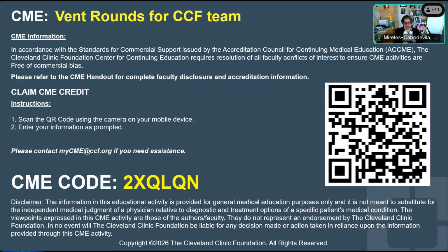Importantly, there are also gaps. I hear you, Jorge. Is there a volumetric capnography simulator? Not to my knowledge. There are websites that have capnography waveforms, but not necessarily volumetric ones. Rob, do you know of any? I know the ASL 5000 by Ingmar tried to simulate that, but I could never get it to work. Other than that, I don't know.